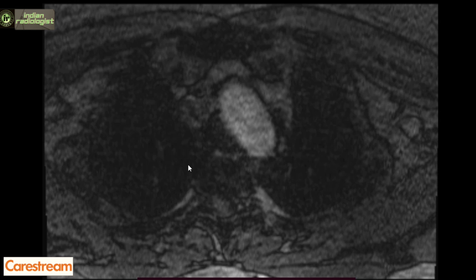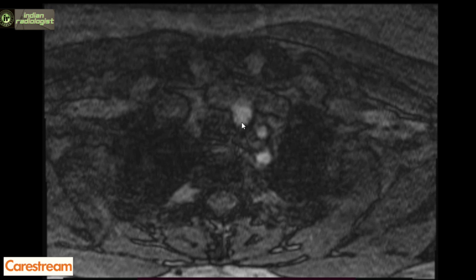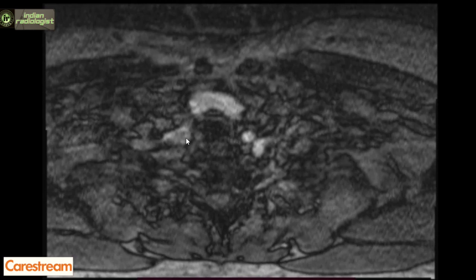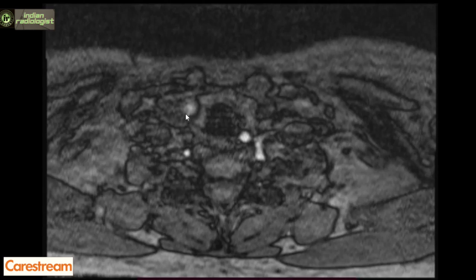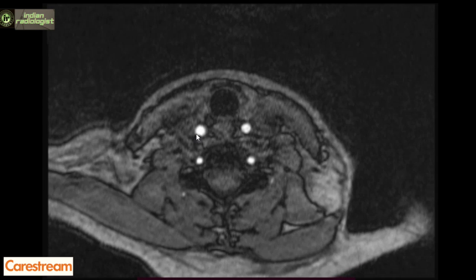We have here the source images of the angiography of the neck. This is the arch of aorta. We first look at the origin of the arch vessels. When we scroll through the images, we can see the origin of the brachiocephalic artery, left common carotid and left subclavian artery. The left common carotid arises directly from the aortic arch. The brachiocephalic artery then divides into the right subclavian and right common carotid artery. The common carotid artery then terminates by dividing into the external and internal carotid arteries.